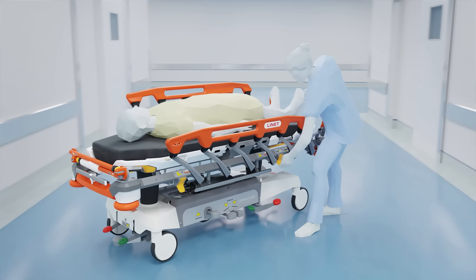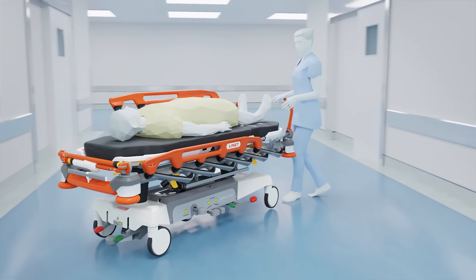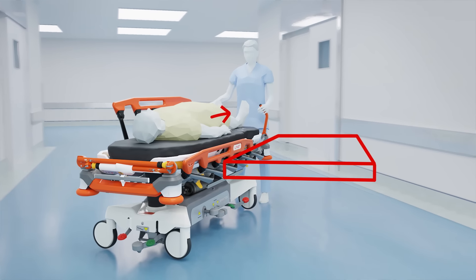Transferring a patient to another surface is often a difficult task. Thanks to the zero-gap principle, side rails help caregivers to do so safely and smoothly.